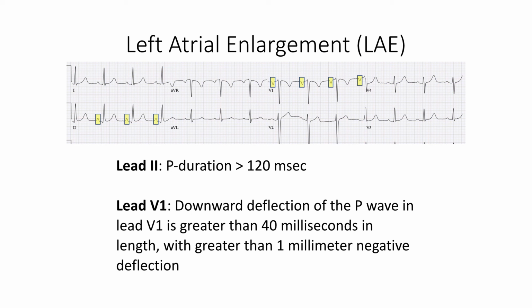lead V1. The reason that we care about left atrial enlargement is that this is associated with atrial fibrillation, heart failure, mitral valve stenosis or regurgitation, hyperthyroidism, and hypertension.